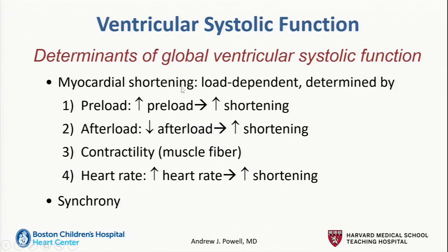And this shortening is load dependent, and the loads are determined by these first three things, but we also need to take into account heart rate as well. And this is part of this echo discussion, but it also comes up in various other things in pediatric cardiology. So the first is preload.